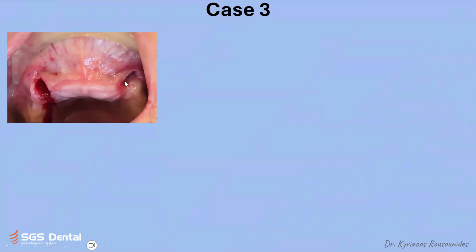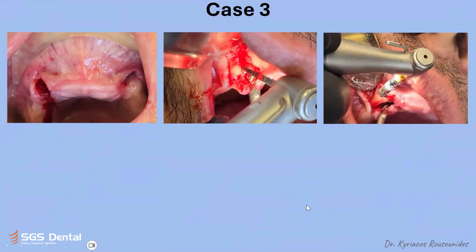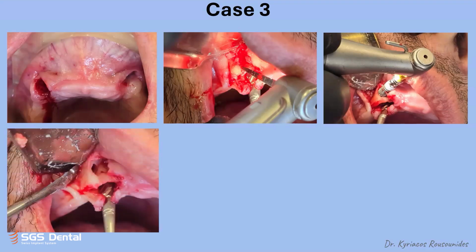We opened both areas to see, first of all, here where he extracted his own tooth, what is underneath, because our X-ray showed some defect of the bone in this area, especially on the back area. We extracted also the 1-3. After it was extracted, the labial plate was missing, and we decided to place the implant with this angulation, as you can see in the picture.